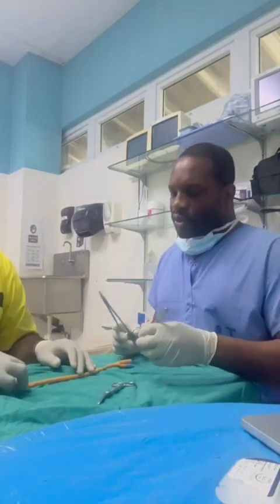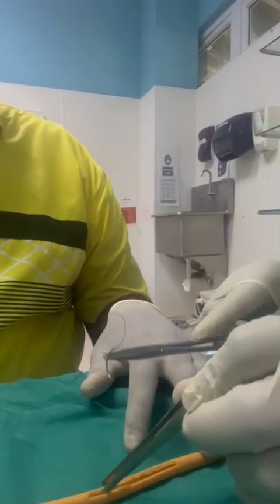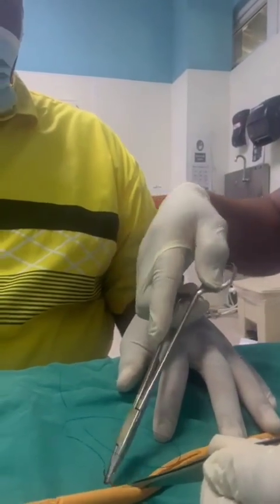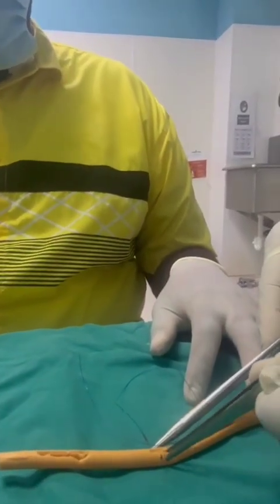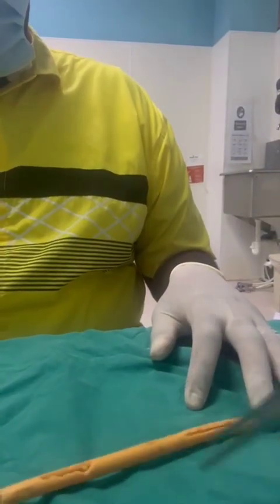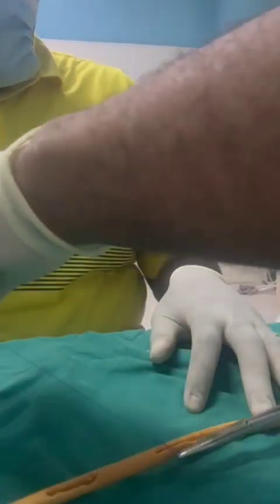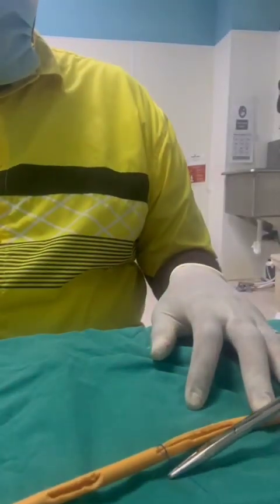Right, so I will show you the interrupted suturing technique. Use the tissue forceps and hold the tissue, enter the tissue at 90 degrees and roll the wrist. Then you can switch, hold the tissue, pick it up on the opposite side. Then you can pull it through. Then to make a knot, we make what we call the surgeon's knot. So 1, 2 throws. Pick up the short arm of the loop, pull in the opposite direction. Then you can pull the knot.